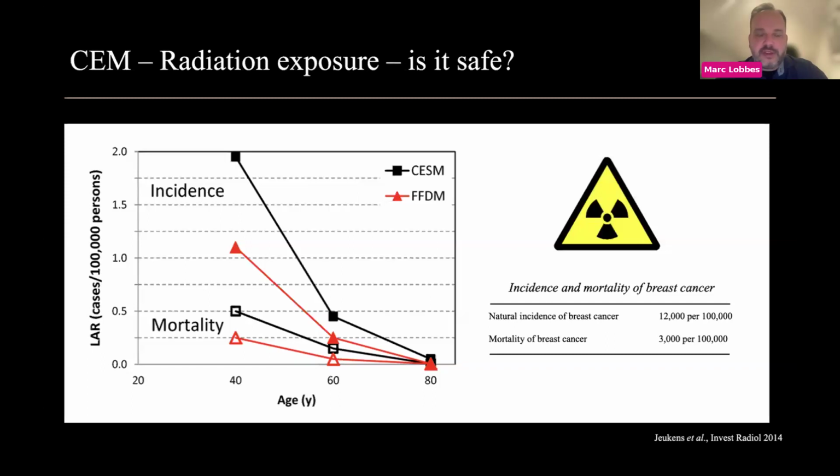And this is a hypothetical risk based on all kinds of modeling that we're used to doing in these questions. Now, if you compare it with the natural incidence or the risk of dying of breast cancer in the general population, it's nowhere comparable. So yes, we still need to adhere to the ALARA principle. I fully agree, but we should also not be too afraid of using the extra radiation when we have a very valid reason to do contrast-enhanced mammography.